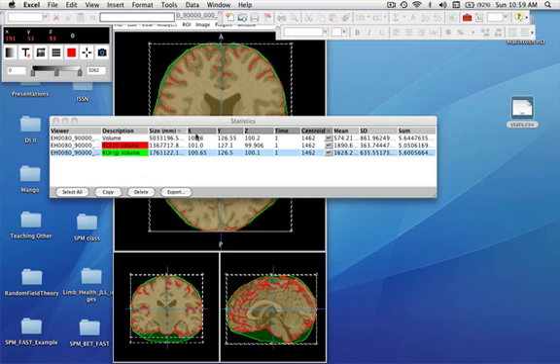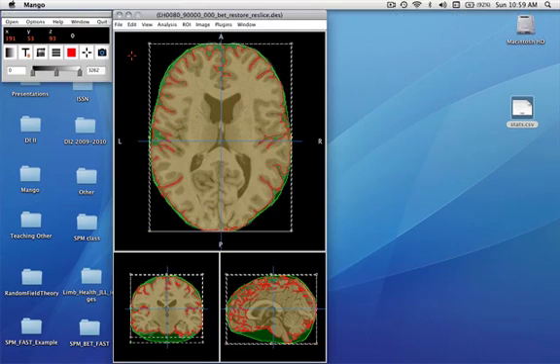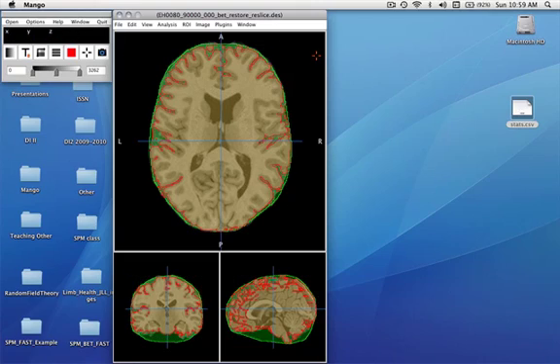This demonstrates some of the features, 3D features, used in Mango for creating regions of interest.